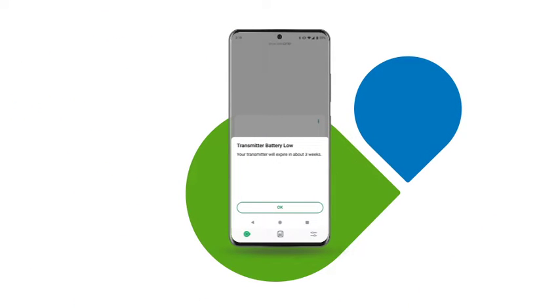Your transmitter will last for up to three months. When the battery is approaching expiration, the app alerts you when it has three weeks left, two weeks left, one session left, and when the transmitter has expired and must be replaced.